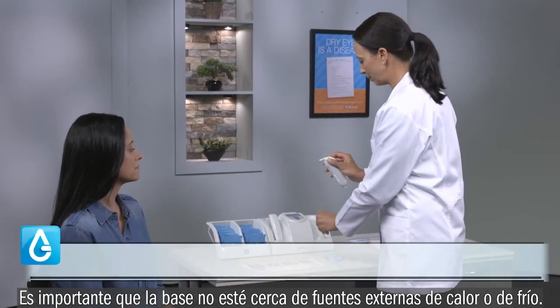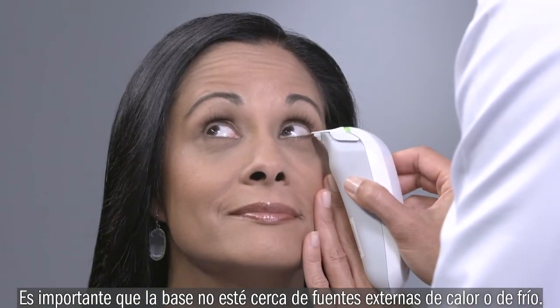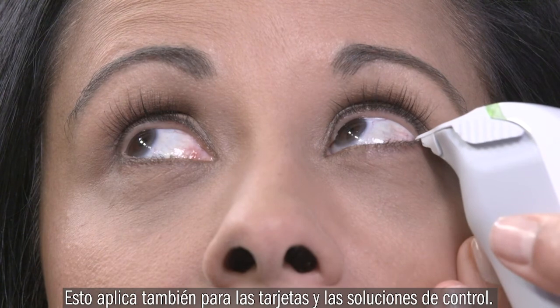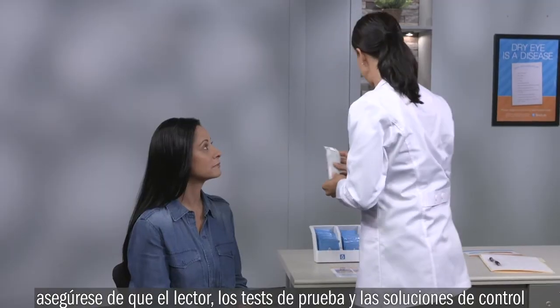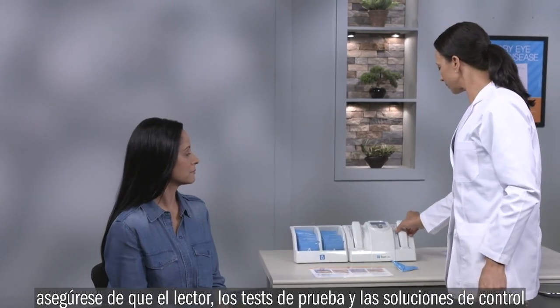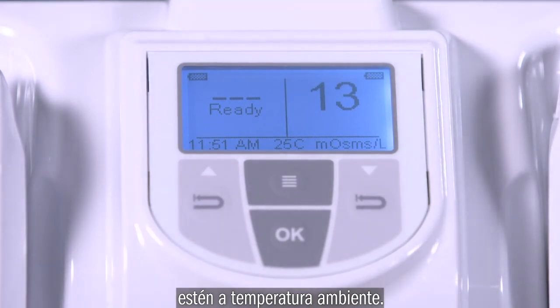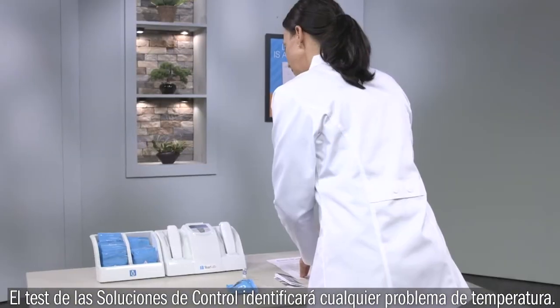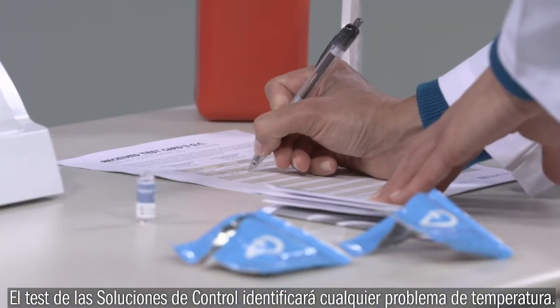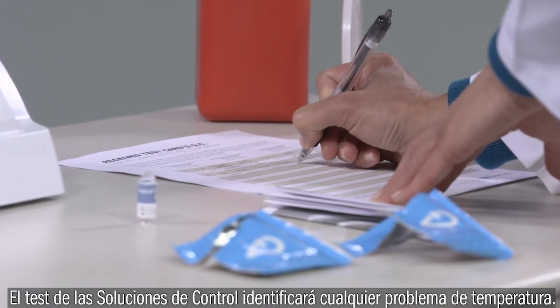It is important that the reader is not influenced by external heating or cooling sources. This applies to the test cards and control solutions as well. To ensure an accurate reading, be sure the reader, test cards, and control solutions are all at ambient room temperature. In addition, test cards can be damaged if they are stored at a warm temperature outside of the recommended temperature range. Performing regular quality control testing with the control solutions will identify any temperature issues.